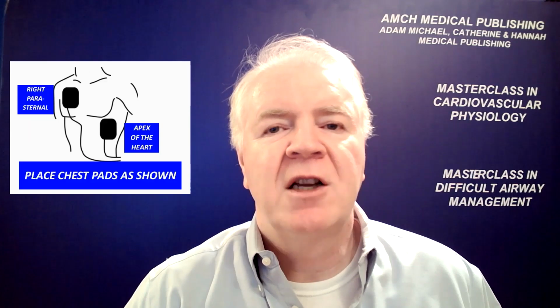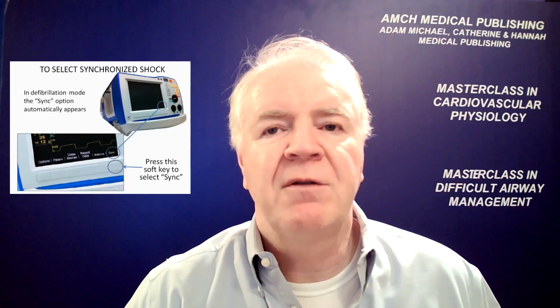SVT, VTach, atrial fibrillation and atrial flutter require synchronized cardioversion, and we will give a very brief account as follows. Apply a cardiac apex chest pad and a right parasternal chest pad. Ensure that the patient's current rhythm appears on the screen of your defibrillator. Select defibrillation mode. The synchronized soft key is now active in the bottom right hand corner of your screen. Press this soft key just below sync on off and the word sync appears clearly on the screen.